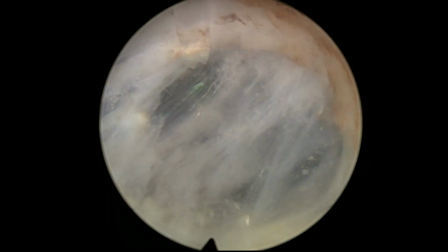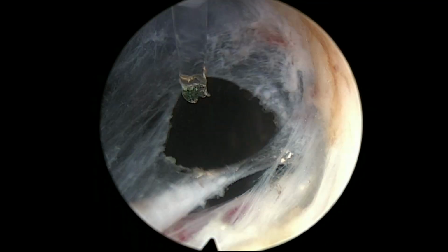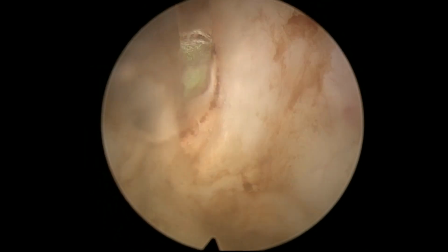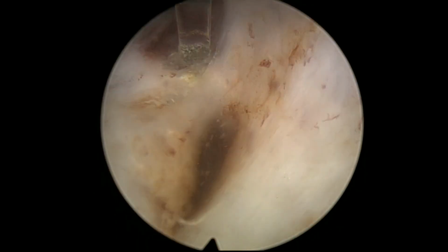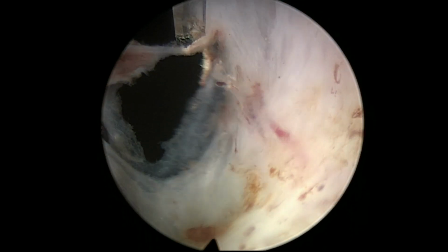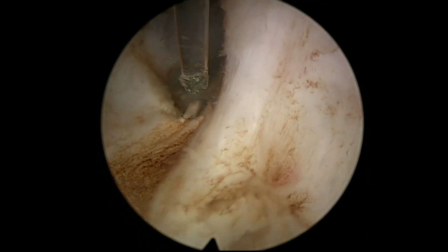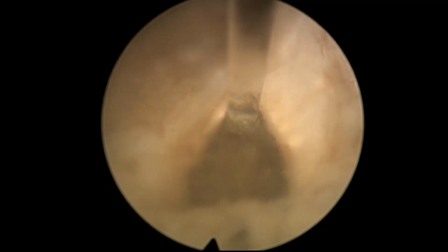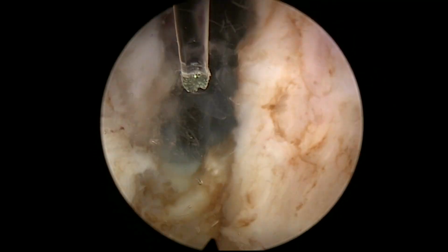One interesting aspect that I find with this laser is that when you use holmium, the explosive effect damages a little bit the mucosa, and there's a tendency for bleeding in the mucosal edge, and definitely you have to do some hemostasis and coagulate the edge of the mucosa when you finish the procedure before you start morcellation. But here you can see that these longer pulses are more hemostatic, and when we open the bladder neck, there doesn't seem to be much bleeding coming from the mucosa.